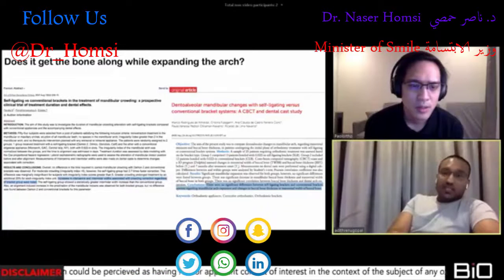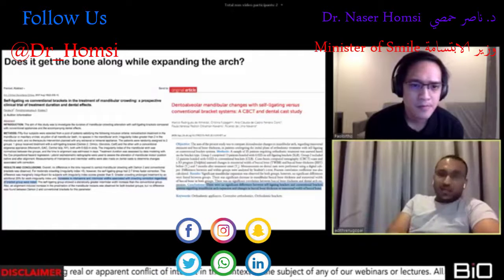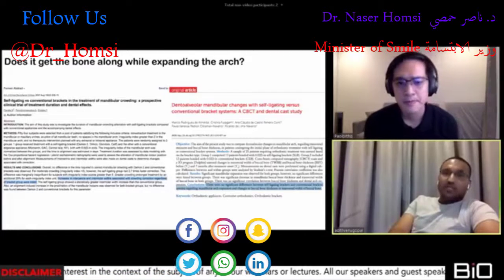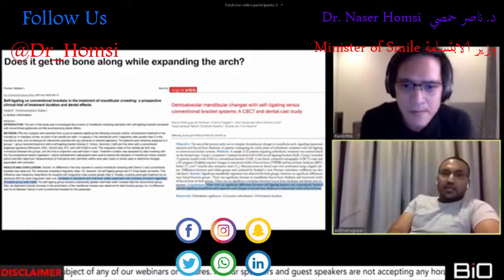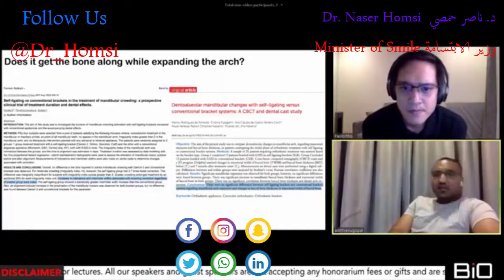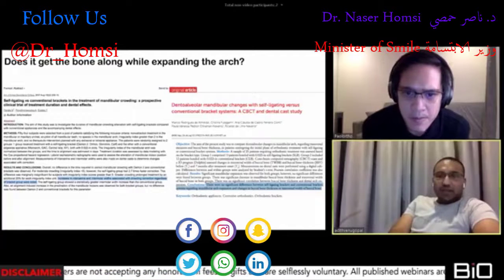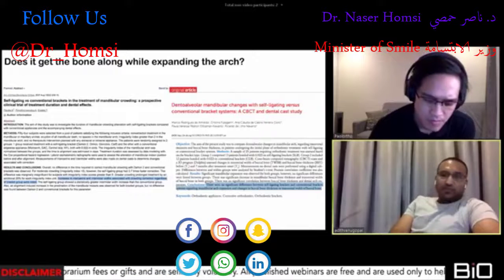Now, the question is, is it stable? Another very interesting paper, published in the Dental Press Journal of Orthodontics by Dr. Almeida, concludes there was no significant difference between self-ligating and conventional bracket systems regarding mandibular arch expansion and changes in buccal bone thickness or transversal width of buccal bone.